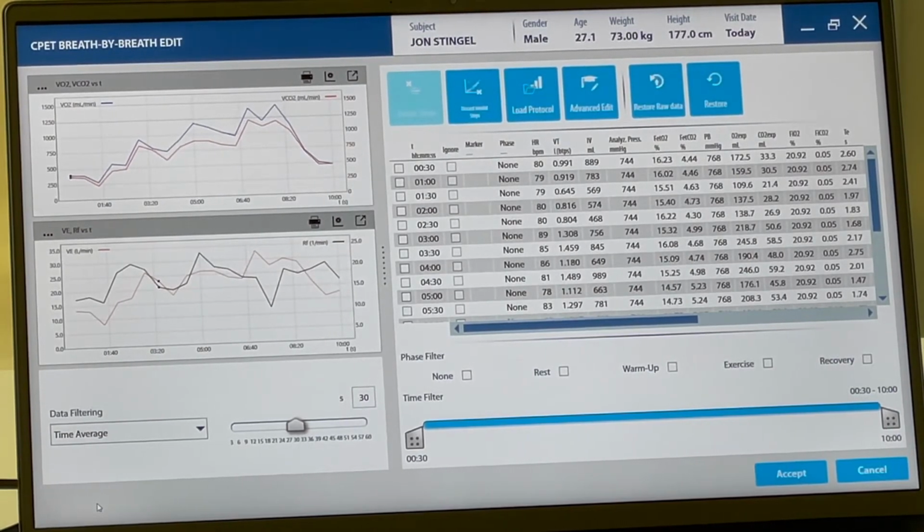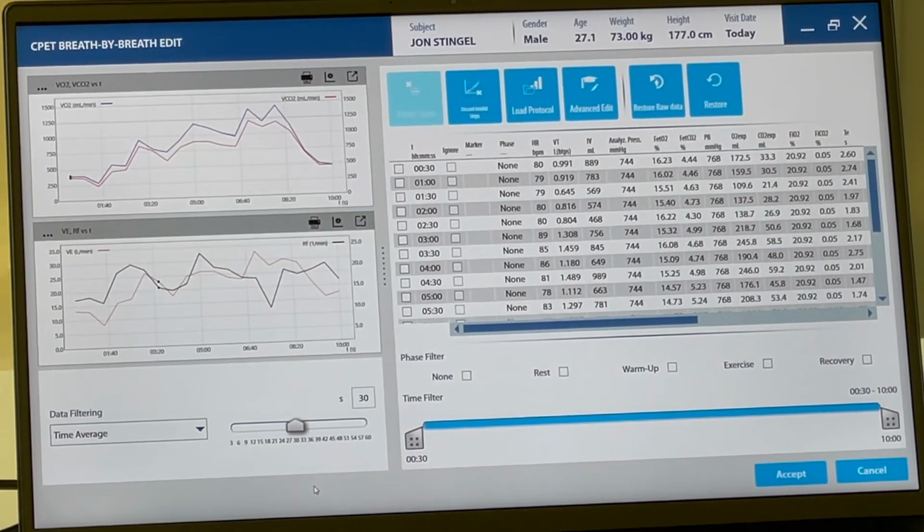Okay. So you could set this one to 20, and it's going to be more similar to the rolling time average, because every 10, the other one updates. Even though it'll still be kind of different and might not overlap perfectly, it's kind of like that.